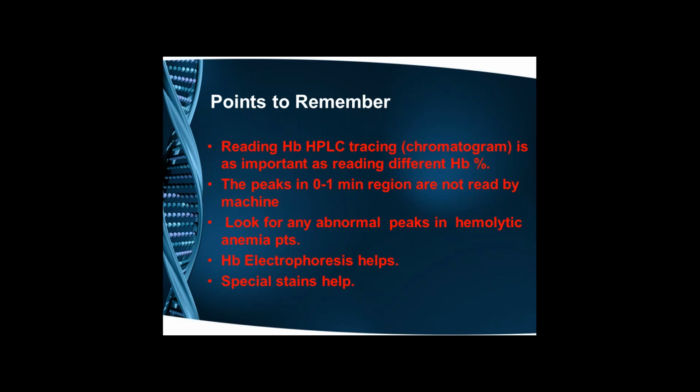So we have to look at the whole tracings rather than looking at the percentages that are given along with it. Any abnormal peak which has not been quantified should be investigated using other methods when required. And if we have some special stains, that definitely helps.